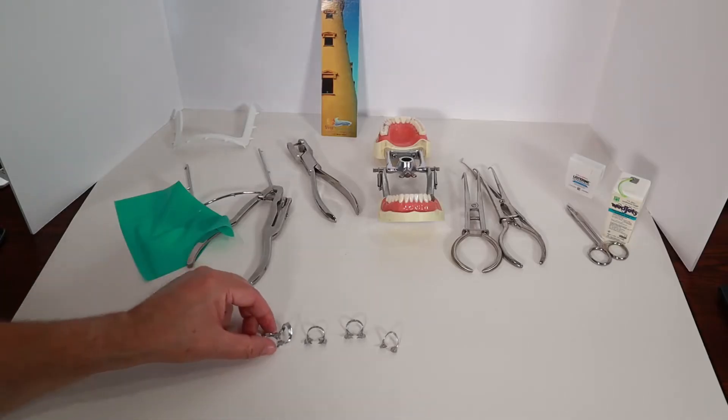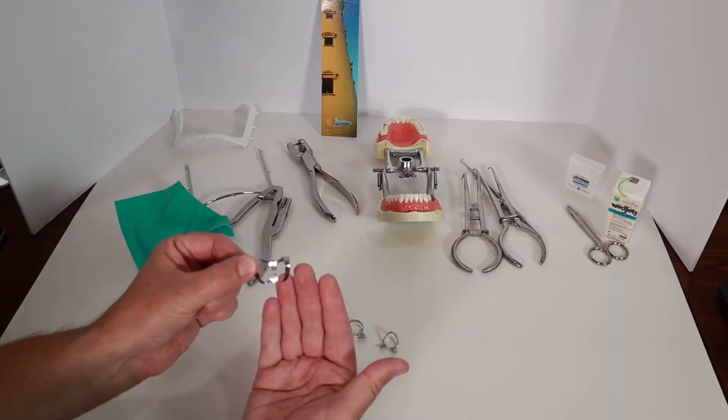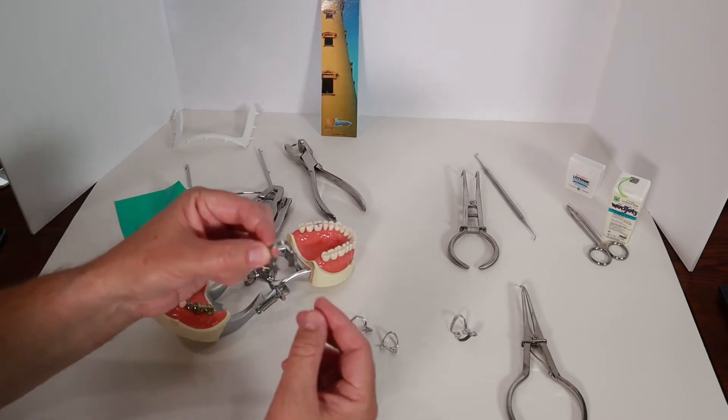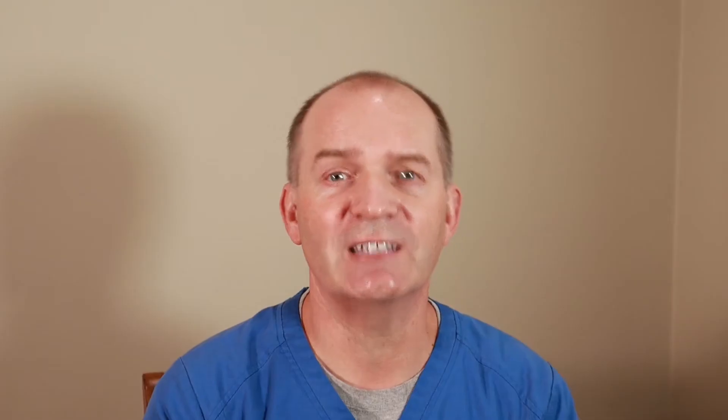Next are the different clips I use to attach the rubber dam to a tooth. The clips come in different shapes and sizes depending on which tooth or teeth I'm working on. These are the ones I typically use — other dentists will have their own favorite clips. This big clip is for front teeth, this clip is for upper back teeth, this clip is for lower back teeth, and this clip is for bicuspids — those smaller size back teeth in front of your molars.